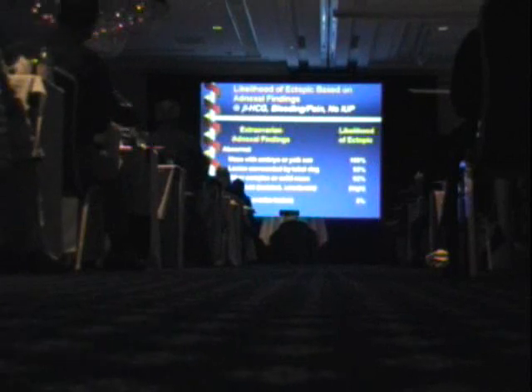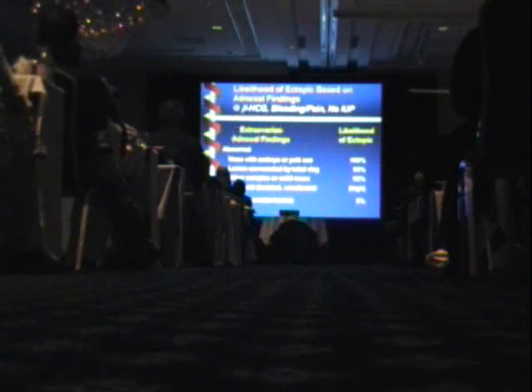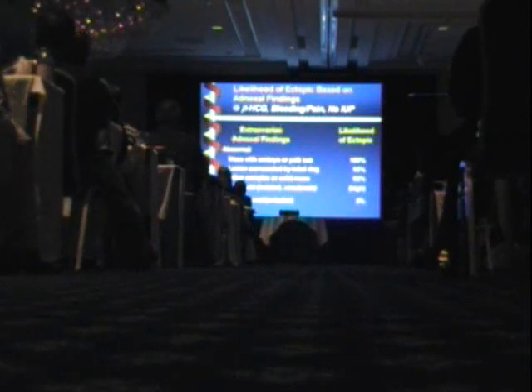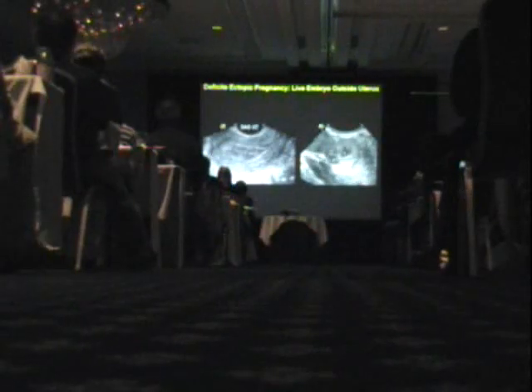The chances are high of an ectopic pregnancy. If you have a rule-out ectopic patient with nothing in the uterus, and the adnexa are normal with or without an irrelevant ovarian lesion, the numbers drop to about 5%. So they're low, but far from zero. In other words, a woman who has a positive pregnancy test, pain, bleeding, and a normal ultrasound has about a 5% chance of an ectopic pregnancy based upon her symptoms and positive pregnancy test alone.